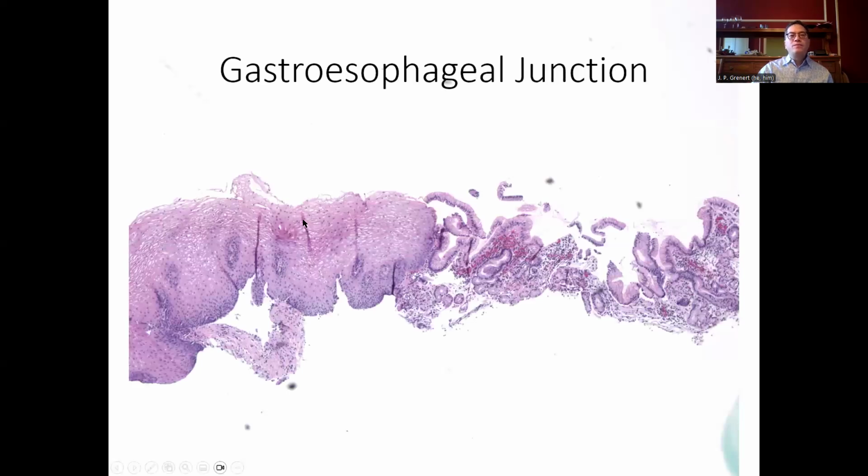Moving down now from the esophagus toward the stomach. So this is the gastroesophageal junction. So the esophagus is on one side of that. That's the E part of the GE junction. And then on the right side here is the G part, the gastric epithelium. So we go from squamous mucosa to glandular mucosa. This is one of the two squamo-columnar junctions that we've got in the GI tract. And so here, this should have glandular type epithelium, and we'll see some of that on higher power. No goblet cells in here, just this pinkish mucin vacuole present in this gastric foveolar type epithelium.